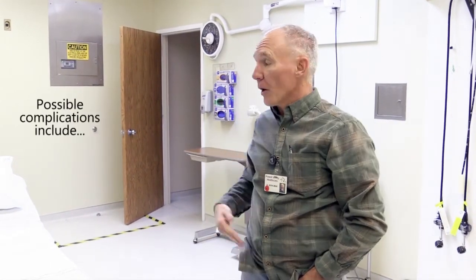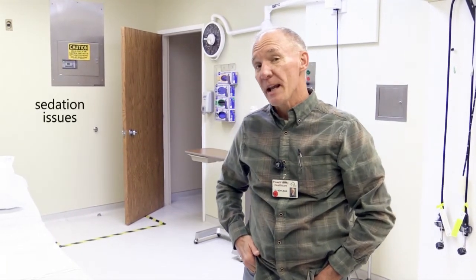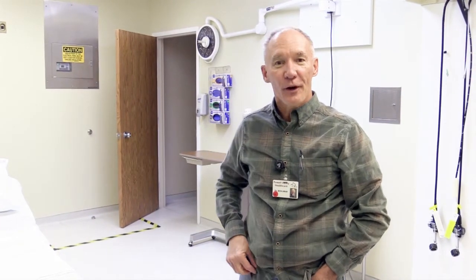And so with colonoscopy, one of the problems you can have is problems with the sedation. If we got you too sleepy during the sedation, then we might have to breathe for you or give you drugs to reverse the drugs that we gave you. That's really rare to have that problem. It's been probably 10 years since I've had a patient who had a problem where we had to give them drugs. I've never had to breathe for anybody.